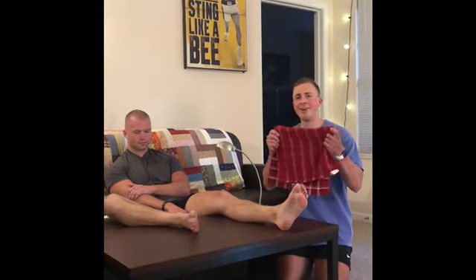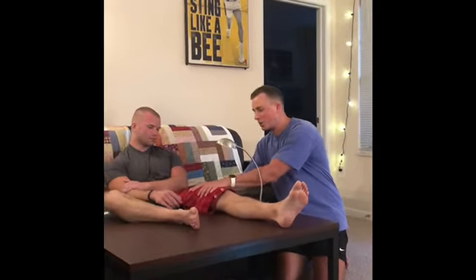All right, so we're going to perform continuous diathermy, producing a thermal effect on Logan's anterior thigh here to improve the extensibility. So you're going to need a towel. We're going to place the towel over the patient's anterior thigh just to soak up any moisture that might occur during the treatment. We're going to explain the treatment to the patient.